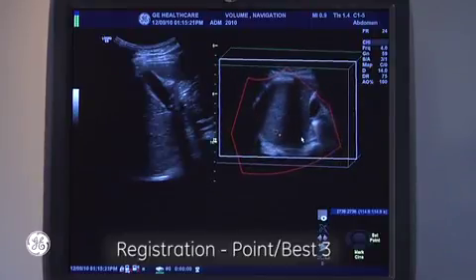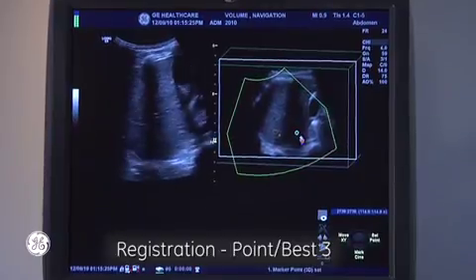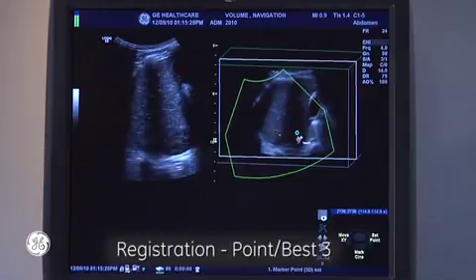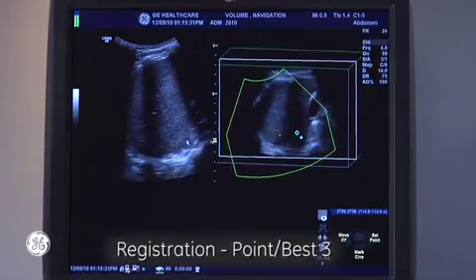First one I'm going to look at is going to be the very top of the kidney, and just mark that off here just by hitting set point. Then my live ultrasound image has come live now. I'm going to find that same location in my live ultrasound.